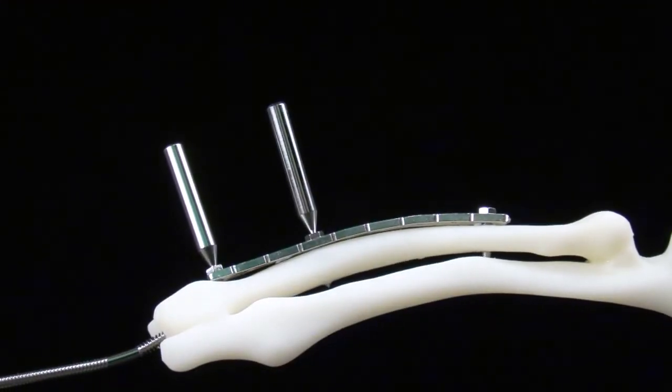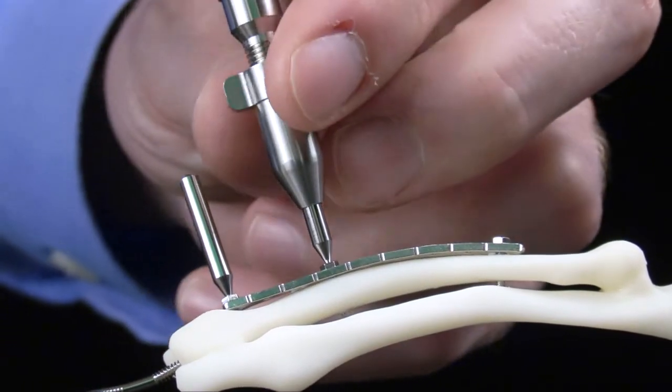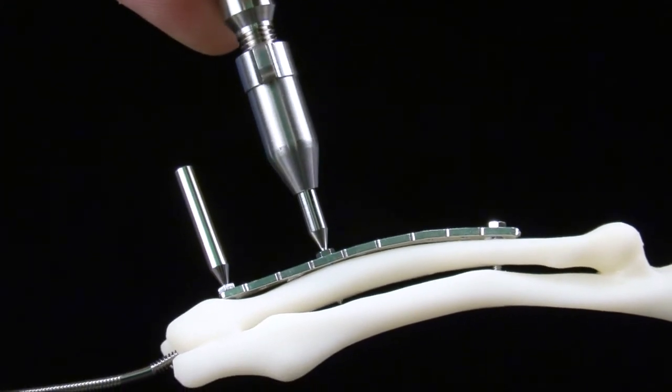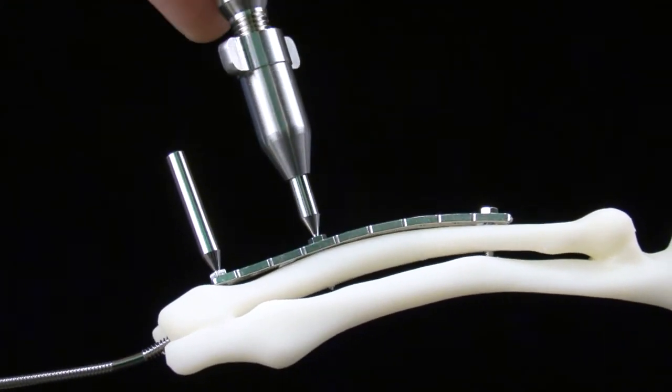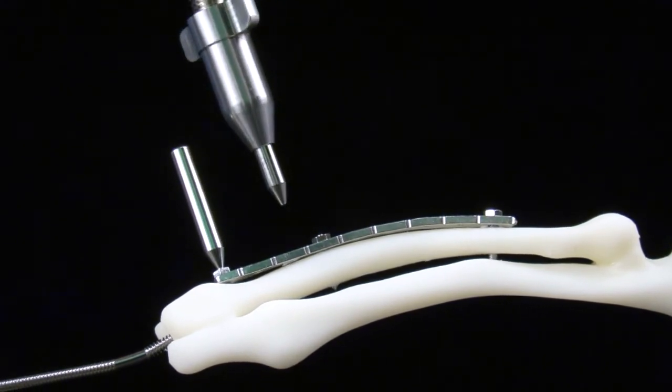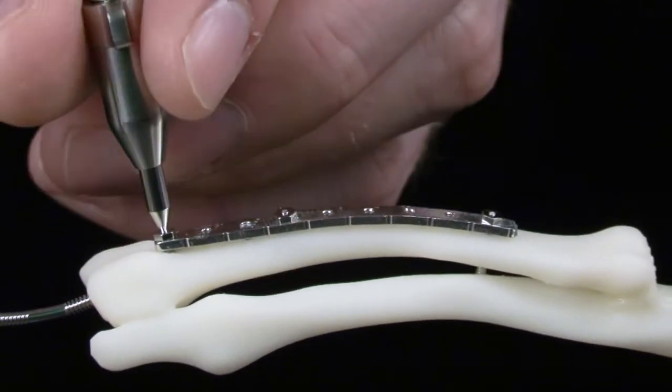Alternatively, with the 1.0 and 1.4 mm screws, the screw can continue to be tightened using the finger driver until the shaft twists off of the screw head. A combination of turn and rock is also effective for shaft removal.